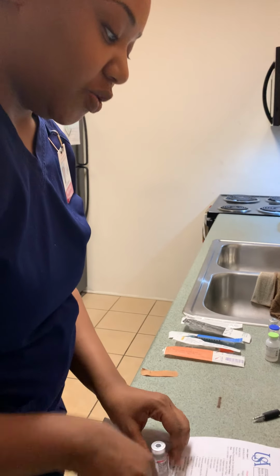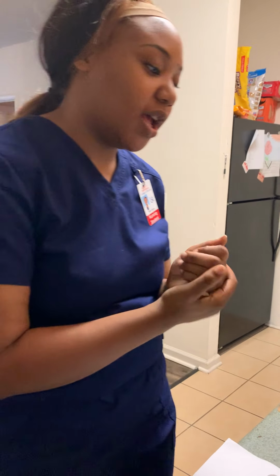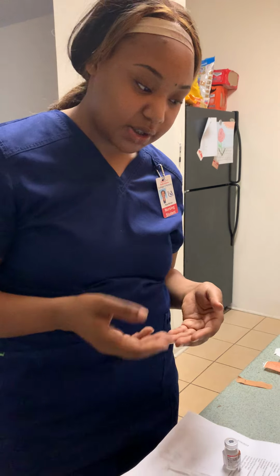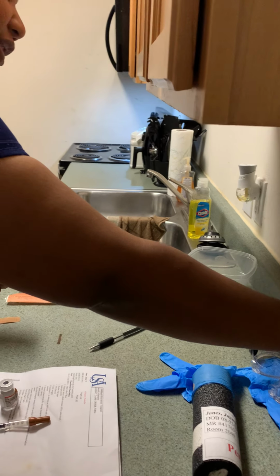So I would go to Jaguar Jones' room and perform hand hygiene, and I would let him know what I would be doing and tell him that the heparin is for his blood clots. I would don my goggles and my gloves.